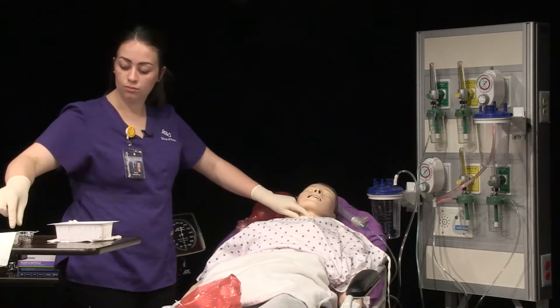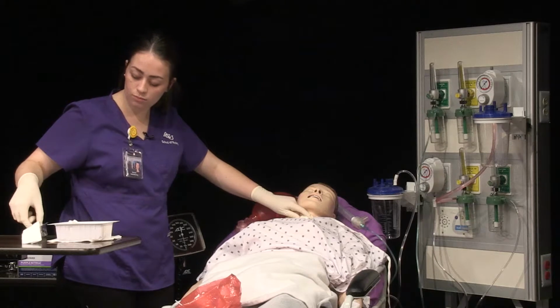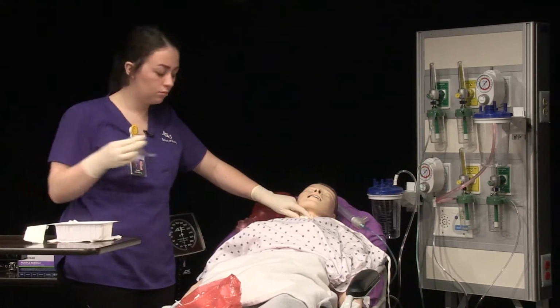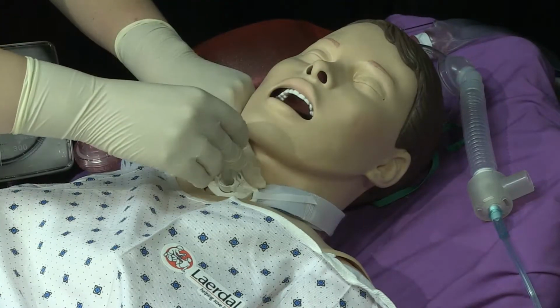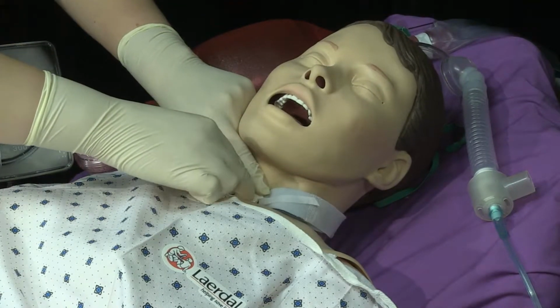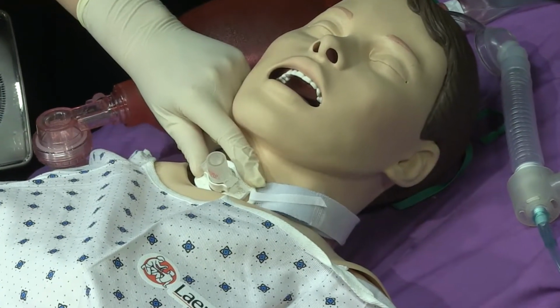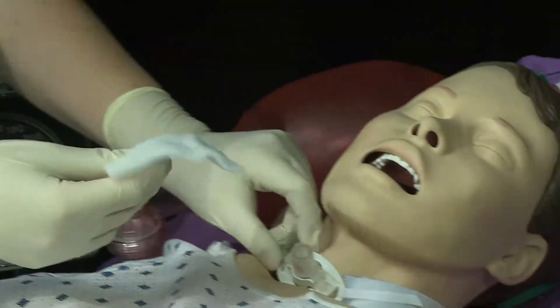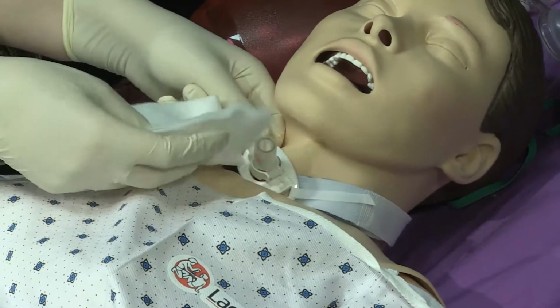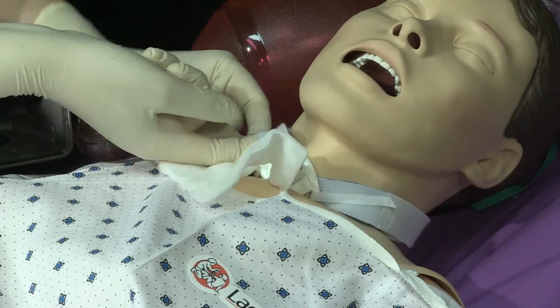Insert new inner cannula. Use dominant hand to position inner cannula properly over tracheostomy. Twist inner cannula to lock into place. Apply bifurcated or folded 4x4 gauze to tracheostomy site. Gently lift one side of the faceplate to insert the gauze and then repeat on the other side.